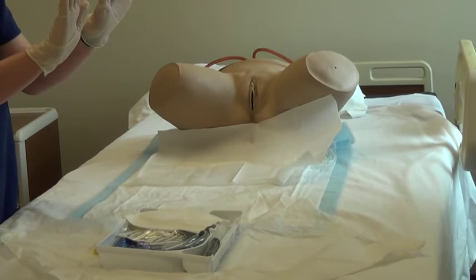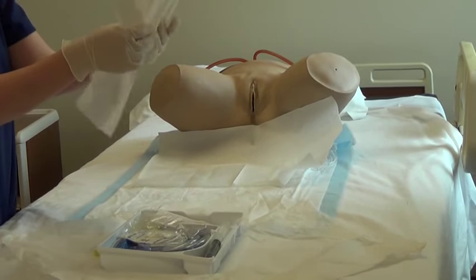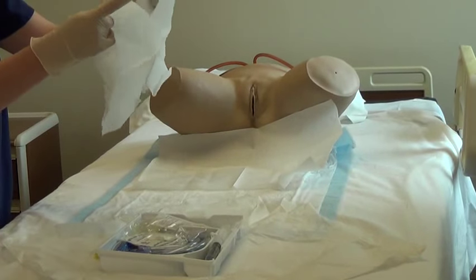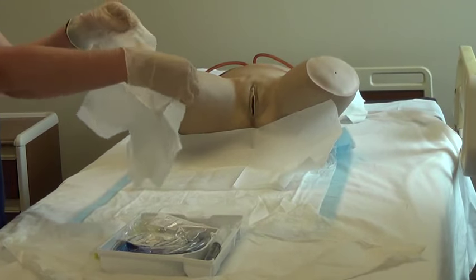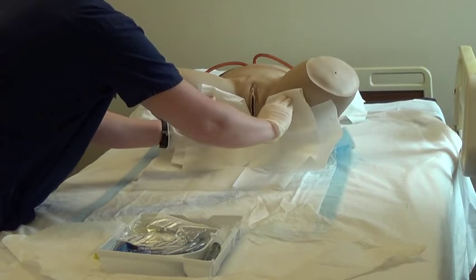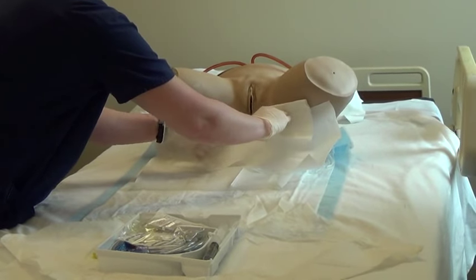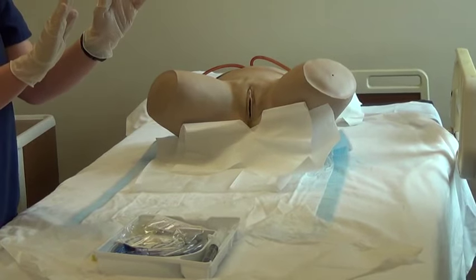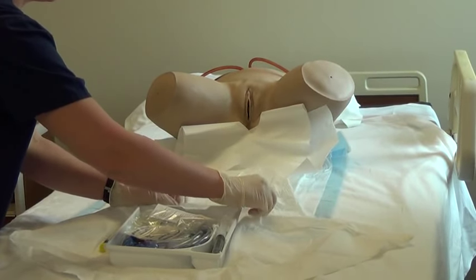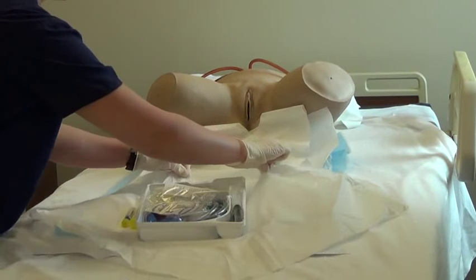Position the fenestrated drape over the external genitalia. You may also fold the fenestrated drape in half and utilize it that way. Advance the tray toward the patient so that the underpad and the outer wrap overlap. You have now just created an extension of your sterile fields.